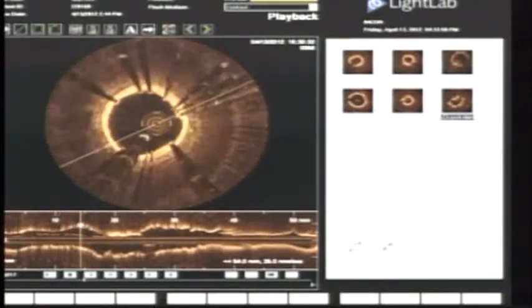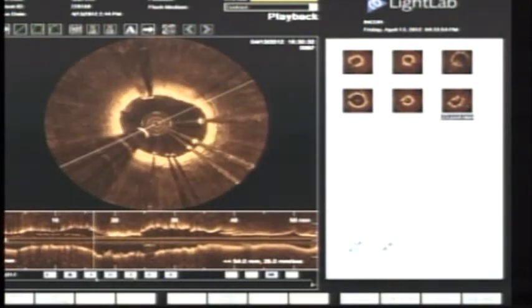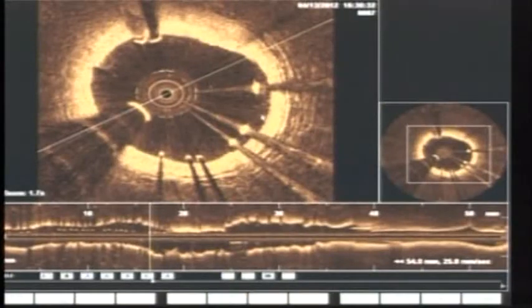So I remember that you had 2 lesions in this LAD, right? One a little bit more focal distal and then a little bit more complex proximal. You intend to stent both, Mark? It seems to be far. Yes, you have 2 lesions, and I will predilate. Make a predilatation with balloon 2.0, and after that I will show you the OCT. Probably I needed it to run.